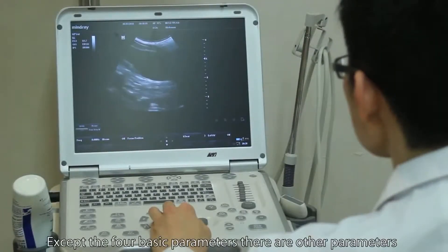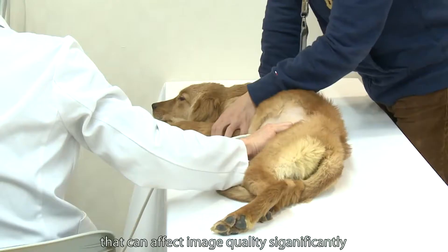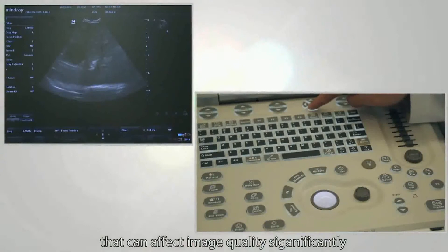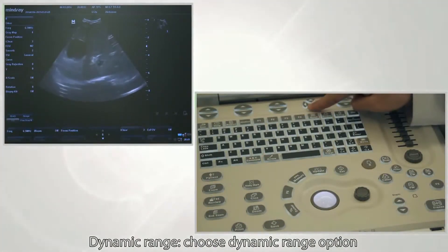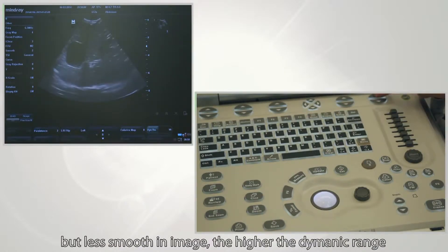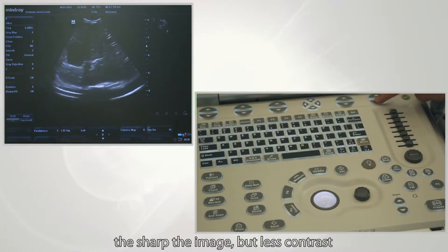Other than the four basic parameters, there are also other parameters that can significantly affect image quality. Dynamic range: choose dynamic range to make adjustments. The lower the dynamic range, the higher the contrast but the less smooth the image. The higher the dynamic range, the sharper the image but with less contrast.